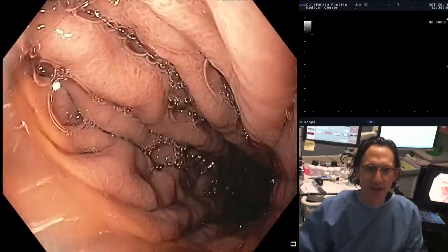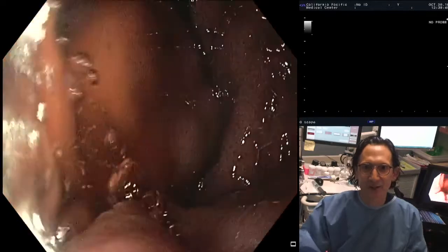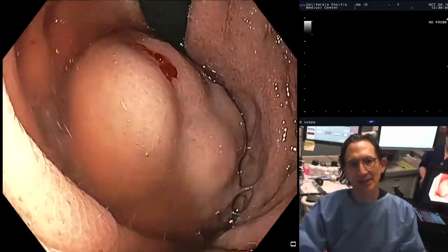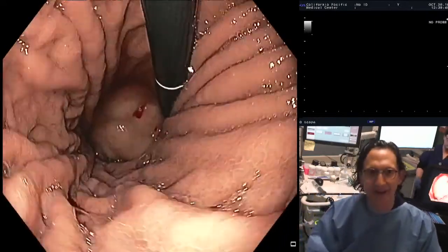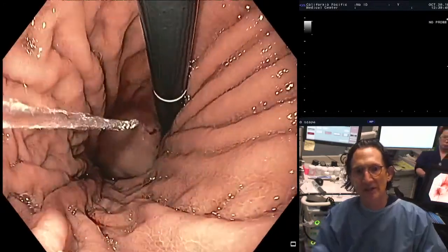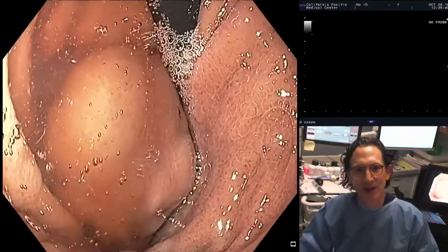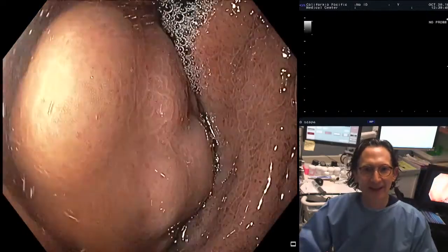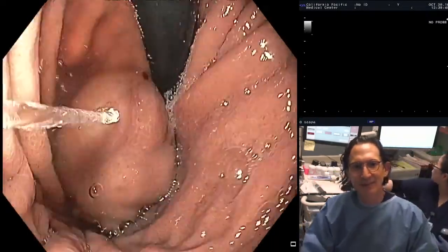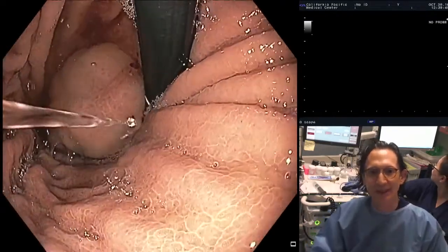So now I'm going to go into retroflexion. Now, what is amazing is there's virtually not a drop of blood. Of course, there's got to be a drop of blood where I punctured. So that might be what you're looking at here. I can't avoid that because I did not go transesophageal. But I'm even going to wash that off for you. See? Look at that. I washed it off. And if I had done that secretly before coming on screen, I could have said there's not a drop of blood. Well, there's one right there.